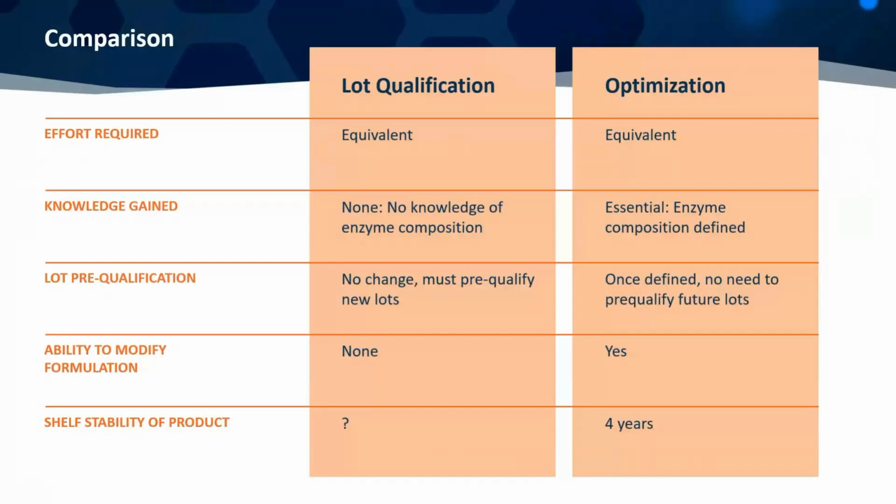And of course, we have good data based on collagen degradation activity that it's good for 4 years. And of course, at times, as I mentioned before, for the collagenase P, you don't know how stable it is over time, because more than likely they're using a peptide assay to measure it, and that doesn't correlate.